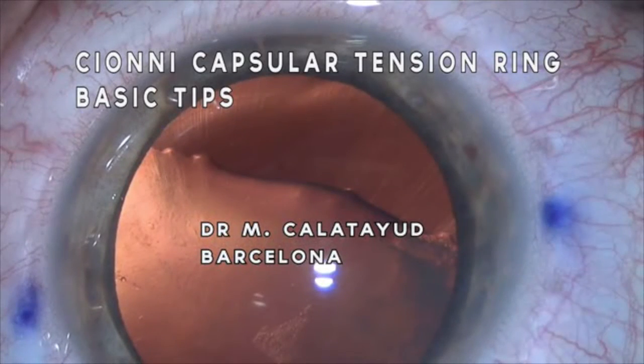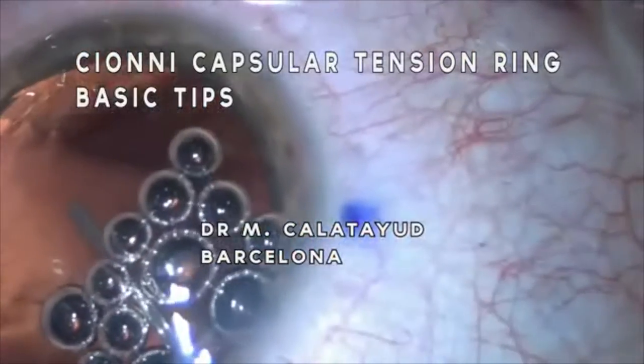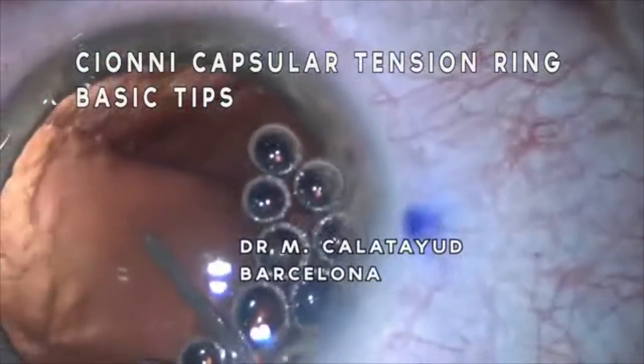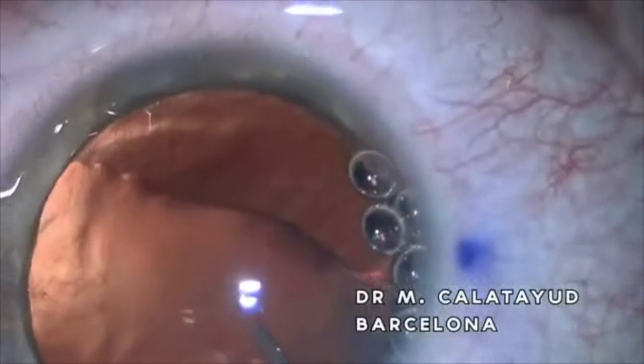We have a young patient with a subluxated crystalline lens from birth, and we are going to try to extract the cataract and position the crystalline back to its physiologic place.